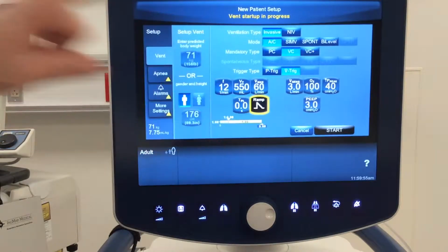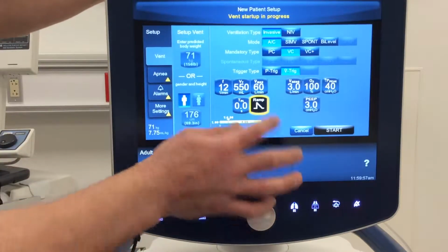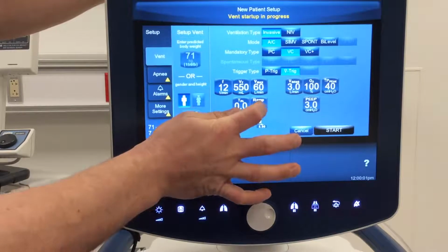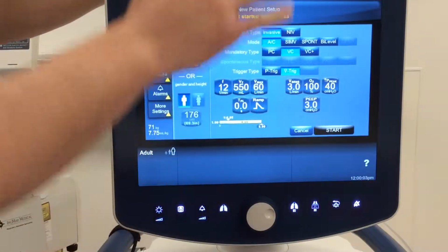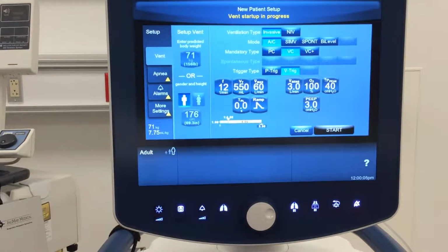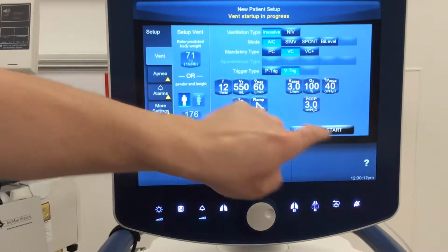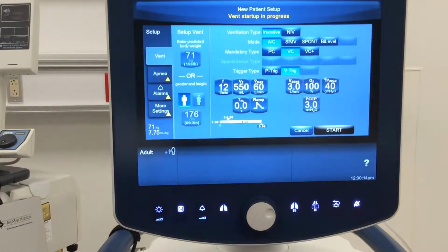Typically at the beginning of the breath for most of our patients. Okay, sometimes that changes a little bit. But what this is doing is it's reaching 60 right at the beginning of that breath, but then just like normal, as that patient's lungs are filling up, it slows down the flow rate. So we're really just reaching that peak flow right there at the beginning, and then it tapers that flow off as the patient's lungs fill up.